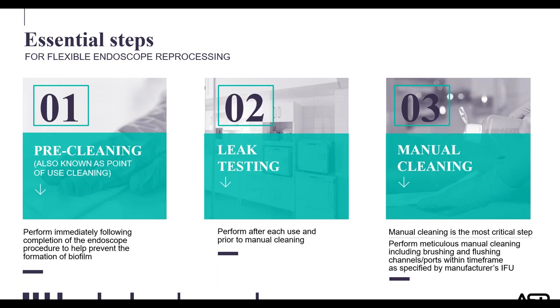Manual cleaning. So manual cleaning is the most critical step. Follow the scope manufacturer's instructions for use. Always use a freshly prepared cleaning solution. Use the cleaning solution in the correct concentration, temperature, and designated time.